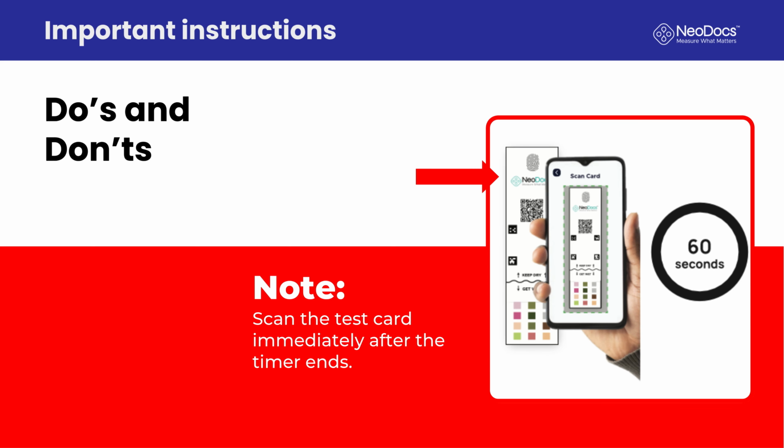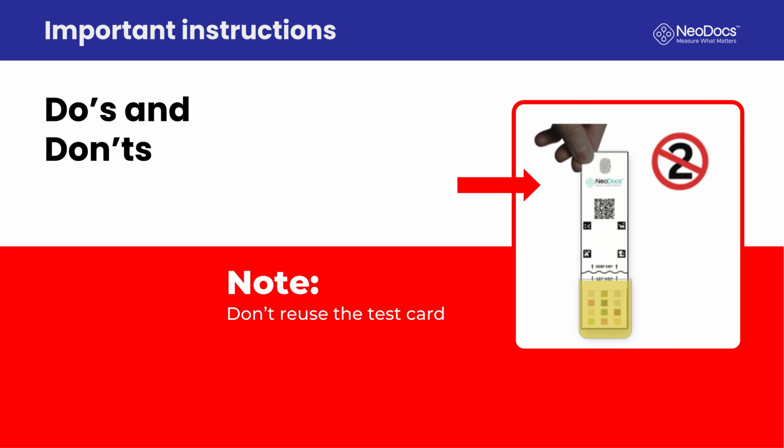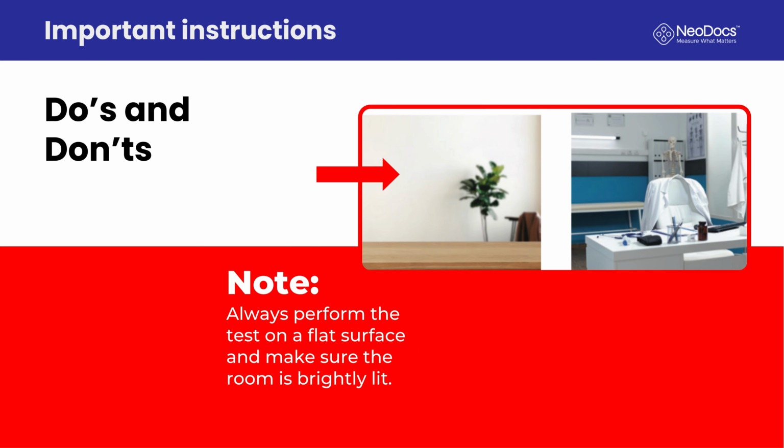Scan the test card immediately after the timer ends. Don't open the pouch before collecting the urine sample. Don't reuse a test card after it's been dipped once. Always perform the test on a flat surface and make sure the room is brightly lit.